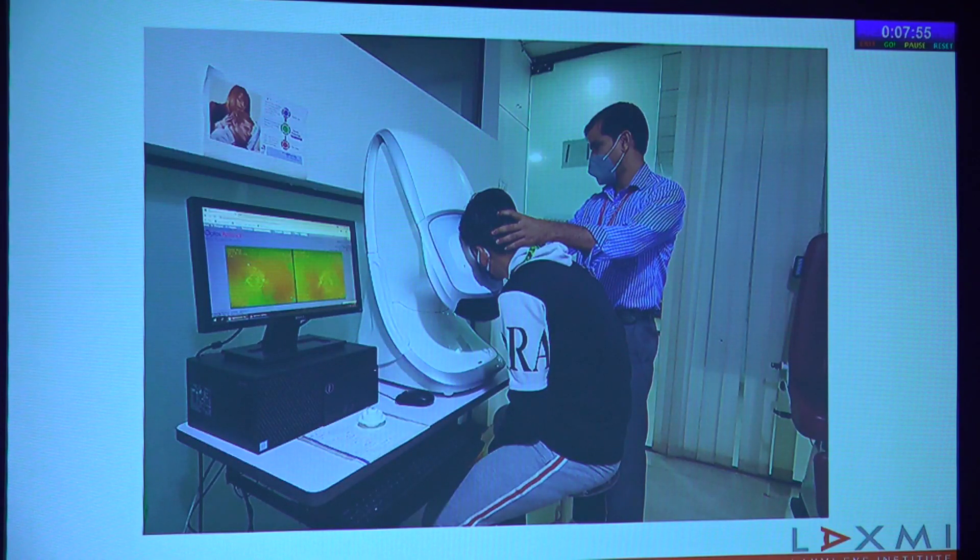Since we have the Optos with us, most of my talk will be restricted to photographs from the Optos machine. It's a very easy-to-use machine. The patient gradually brings his or her eye to the camera aperture, which is covered by a silicone sleeve, protecting it from dust and inadvertent touching. A technician can gently guide the patient's head, and the machine takes a photograph in a matter of a few seconds.